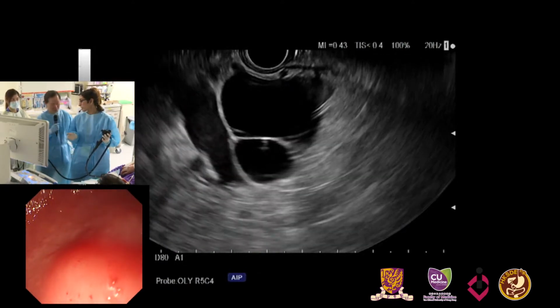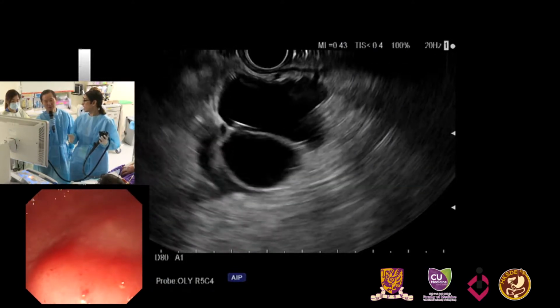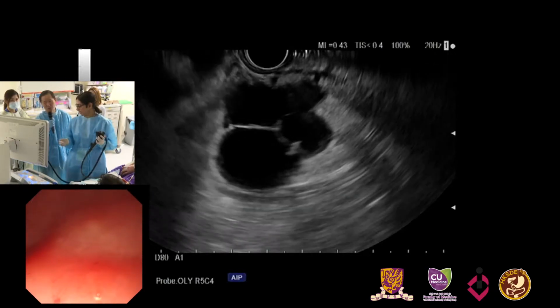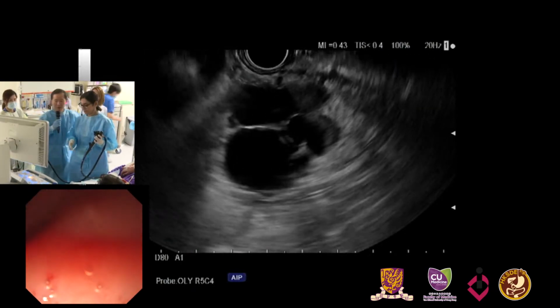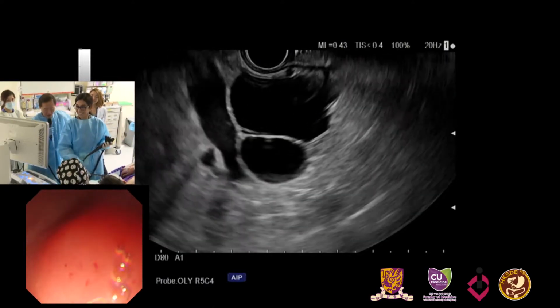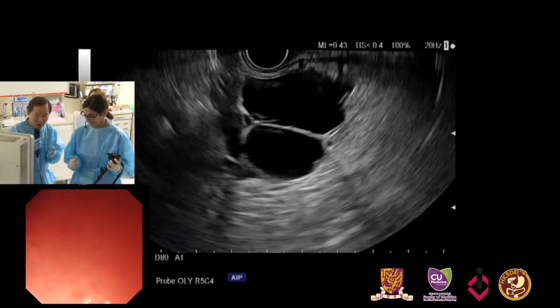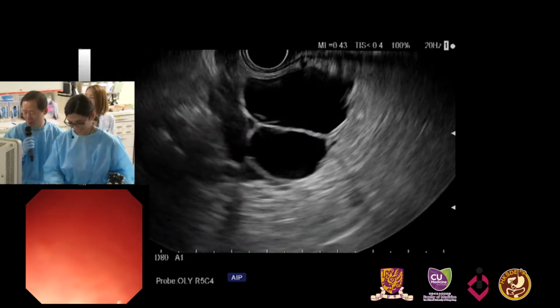And I agree, especially if this is an enlarging lesion, you were going to consider surgical resection. Right. It would be a Whipple. It would be nice to get more confirmatory testing. Right. So what do you think about perhaps confocal? In this case, if we add confocal endomicroscopy, we can get more data supporting our speculation, IPMN.